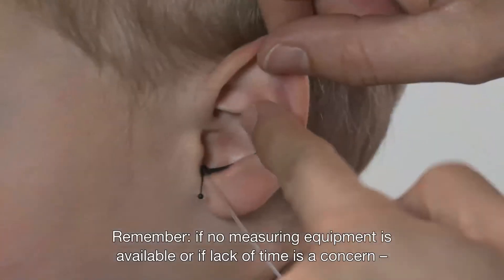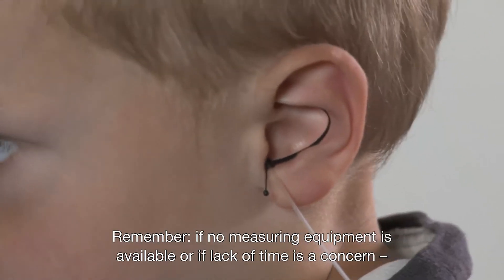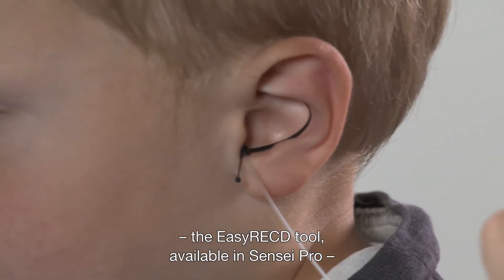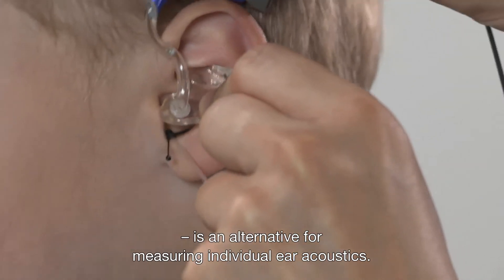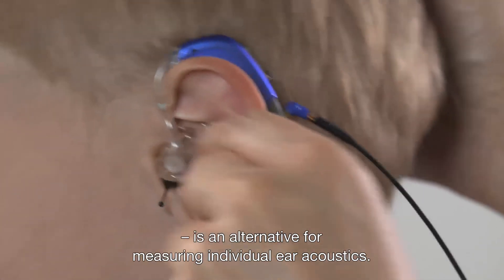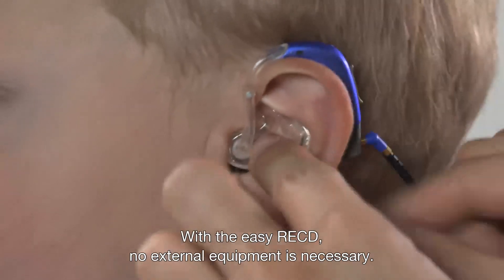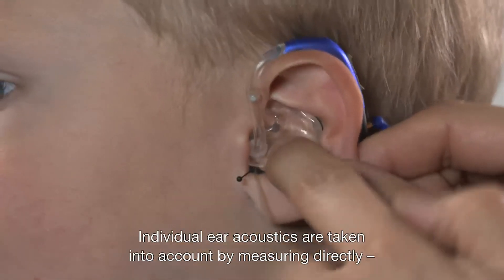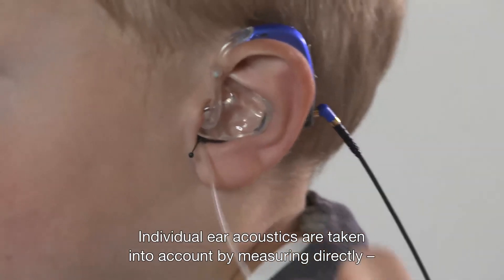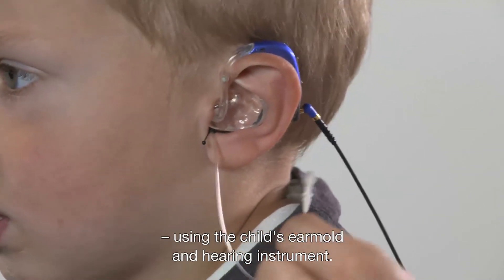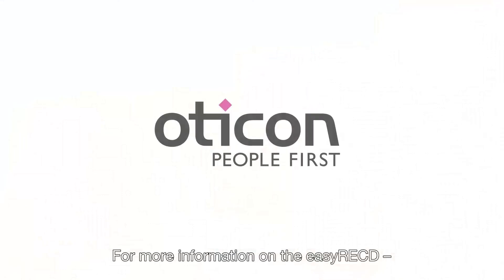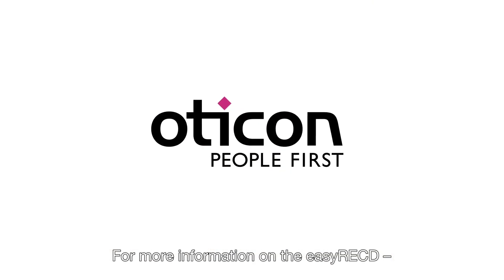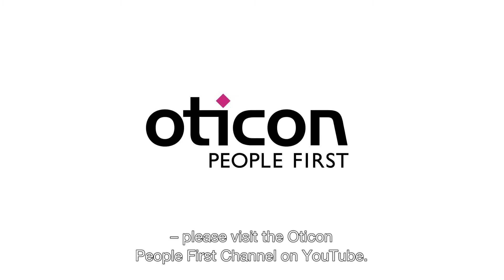Remember, if no measuring equipment is available or if lack of time is a concern, the EZ-RECD tool, available in Sensei Pro, is an alternative for measuring individual ear acoustics. With the EZ-RECD, no external equipment is necessary. Individual ear acoustics are taken into account by measuring directly using the child's ear mold and hearing instrument. For more information on the EZ-RECD, please visit the Oticon People First channel on YouTube.